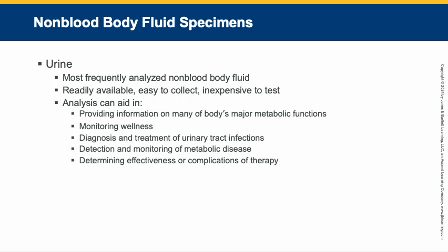You need to be able to properly explain this urine collection procedure without embarrassing the patient. You need to use language adapted to the patient's level of understanding, and we're going to discuss that in a little bit for the verbal words that you're going to need to say. If it's an outpatient area, usually these instructions are posted on the wall in the restroom in the patient urine collection areas. But if it's not, and you just have to tell the patient, you need to be able to verbally instruct them as well as hand them some written instructions if your facility has that available.